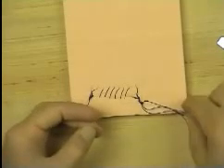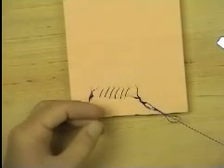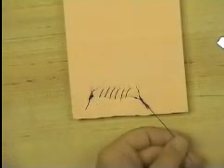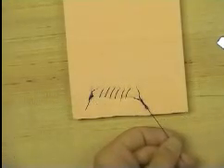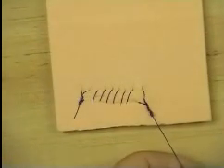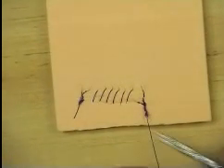The final step is to bring the suture and needle through the loop and tighten firmly. Remember to leave a slightly longer tail when dividing the suture due to the memory of the monofilament material.